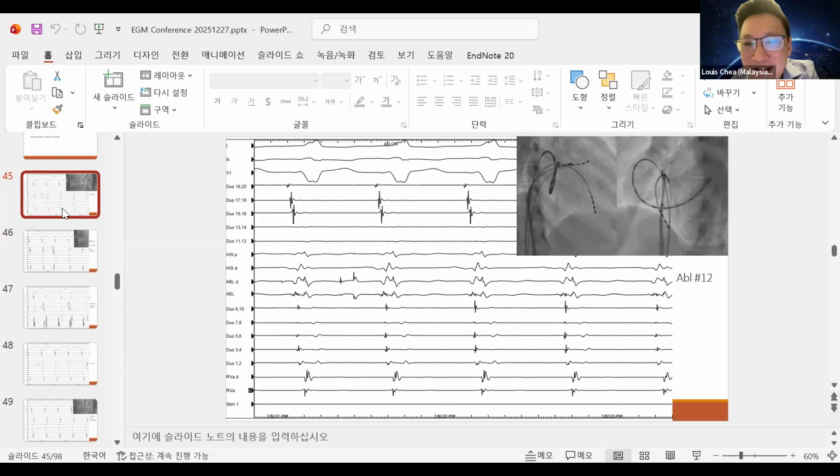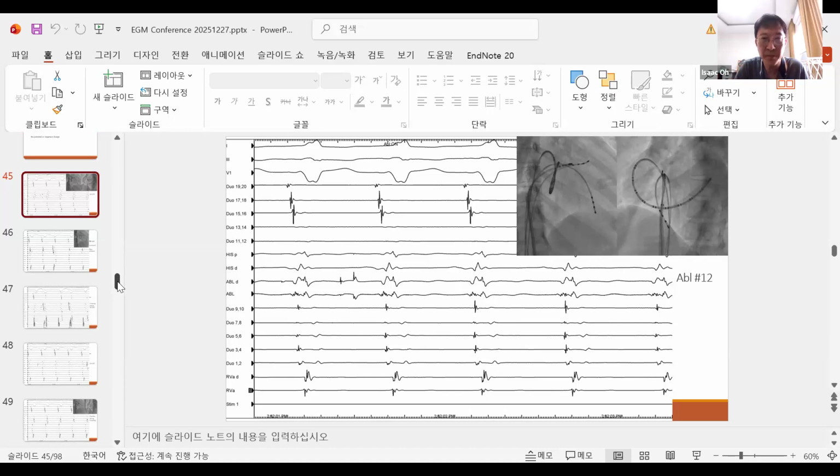It was a great effort, but I think it was a bit brave of you to ablate. What was the length? 8 hours for the first procedure. Yeah, but I think that shows the pitfall of not getting a good his signal, and then it led to a sort of wrong misconception of the septal pathway, where it could be more anterior.